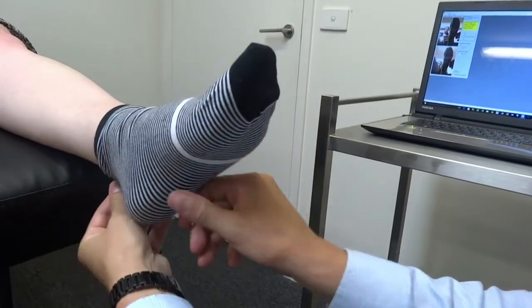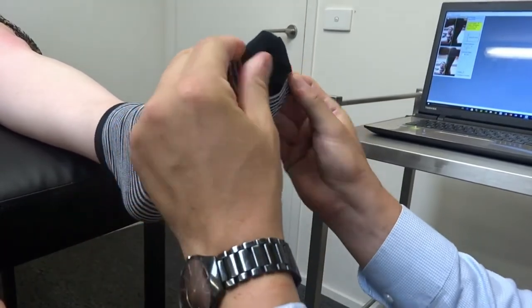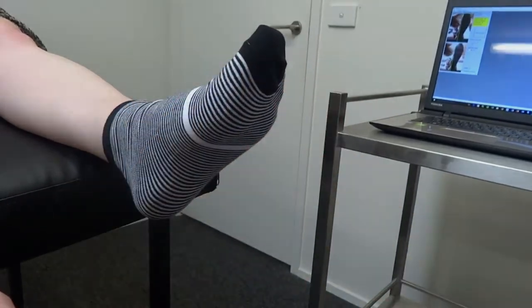The white band should be at mid-metatarsal shaft, behind the metatarsal heads, between the metatarsal heads and the apex of the arch.